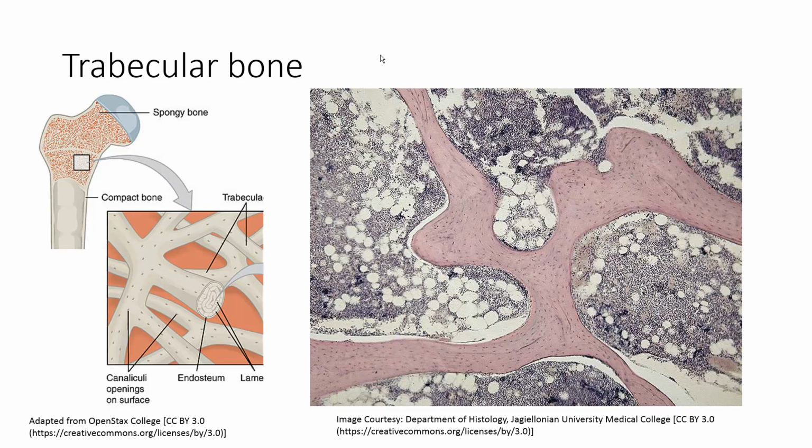In our cartoon here, they're showing you the spongy bone in the epiphysis of the femur. But what you can see is that if we look down here at this bottom portion, the osteocytes are arranged in layers. It is lamellar tissue. So if you were to take this in cross-section, what you would see is still multiple rings. You can see it in the illustration over here.